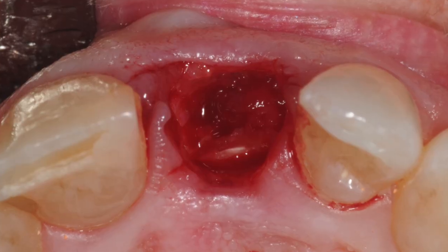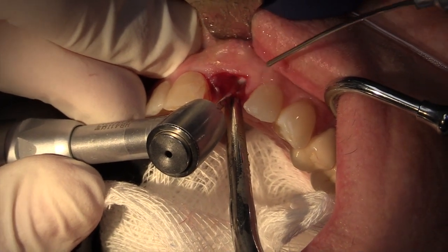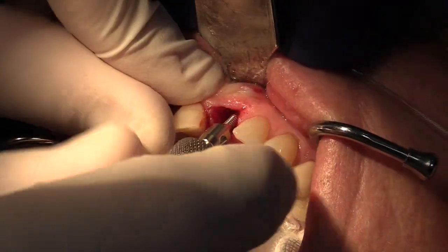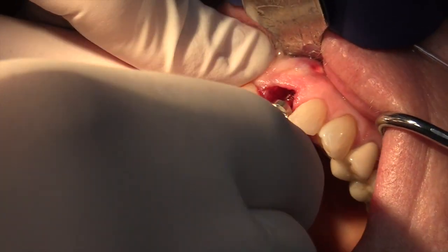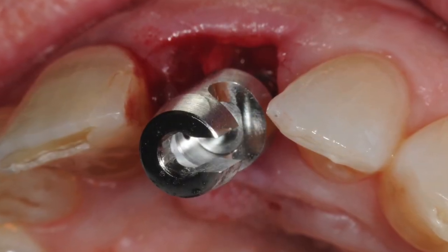To begin, a precise channel is prepared in the canal using a surgical burr. Next, a corresponding retaining pin is inserted in the prepared channel and twisted until it is tightened in place. The threads provide good mechanical retention of the pins in the root.